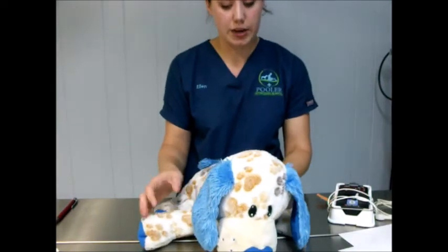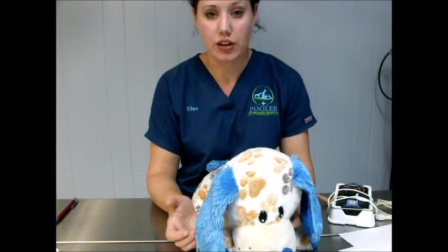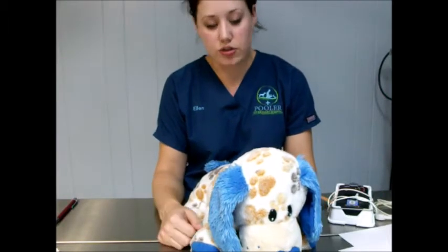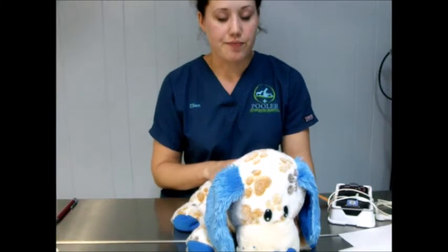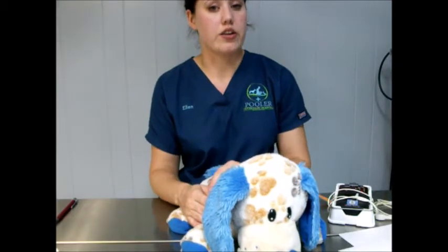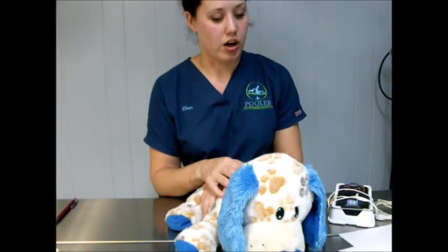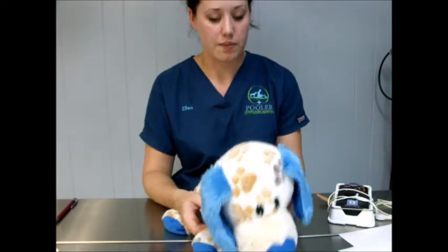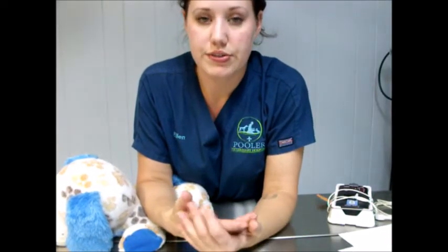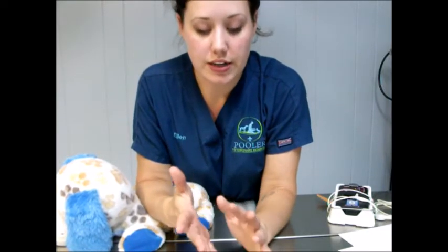The last one's going to be respiratory pattern. That's going to let you know if a patient is potentially feeling stimulus, such as the surgeon making the incision, putting towel clamps on, etc. You'll see hyperventilation. And then, of course, the deeper they go, the more decreased the respiratory rates get. So that's something you want to watch out for, to make sure that they're not going too deep and losing their respiratory rate. So we want to make sure that we are using those vital signs and those reflexes together to figure out how deep that patient is under anesthesia.